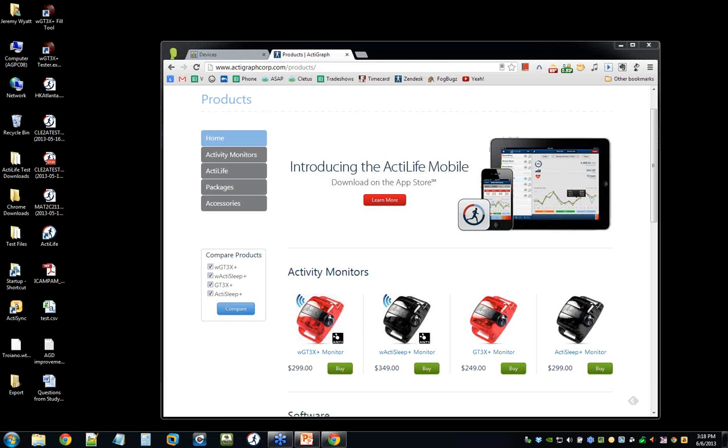I had a question from Madeline that says, if I upload here instead of ActiLife, can the data be saved in the same formats? Yes. We're working on that now, Madeline, and a few of the customers that are using this today are not using ActiLife, so we're experimenting with the best ways to do that. But our plan is to allow you to get the data out and do processing in ActiLife with it eventually. So today, no, but eventually, yes.